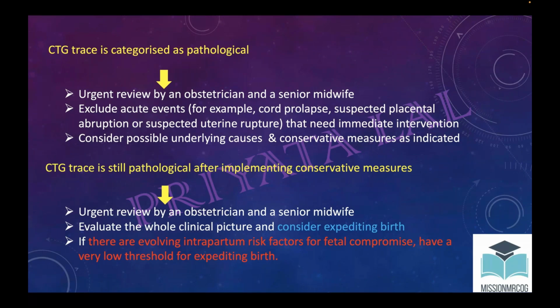In the previous guideline, when the trace used to be pathological, first they used to exclude acute events, then they used to do fetal scalp stimulation, then they used to do FBS, and then they used to do expedition of birth. But now everything has been changed.